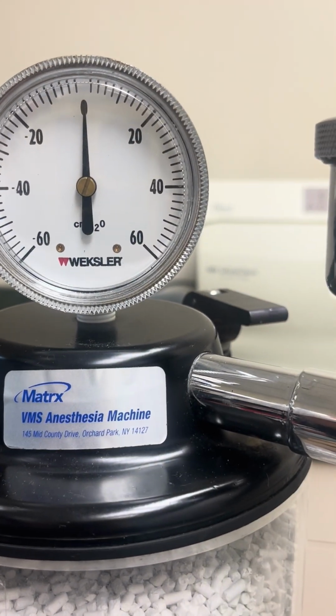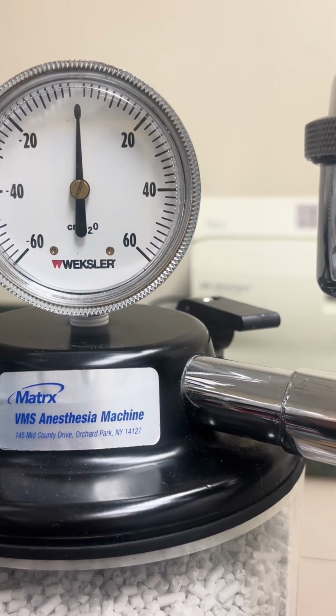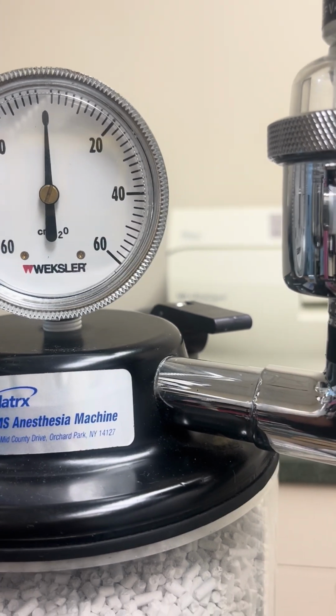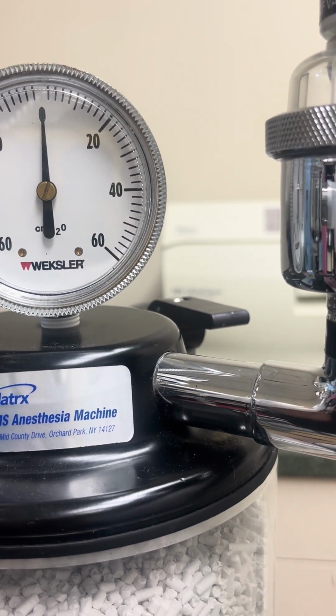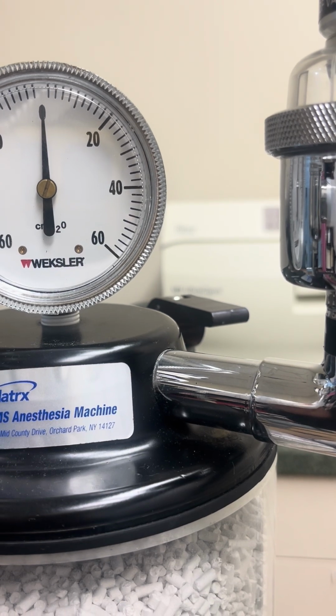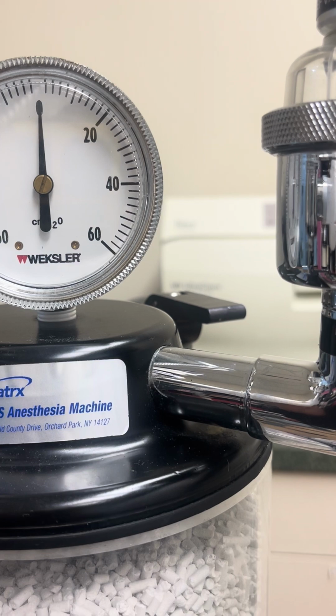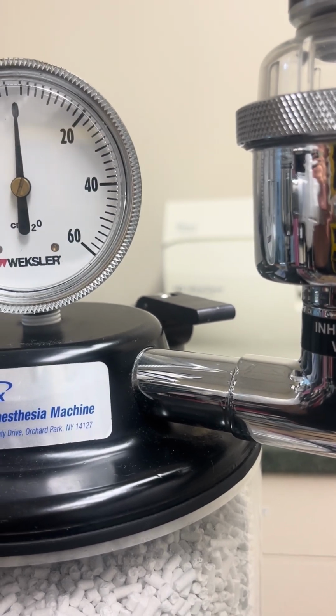All right, then our next step is the manometer. This shows the amount of pressure in the breathing circuit. Negative pressure release valve allows room air to enter and regulate the reading. It should never be higher than 20 centimeters of water for small animals for both pressure checking and IPPV.